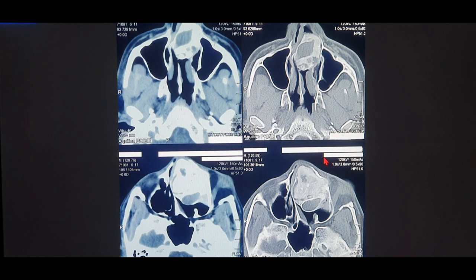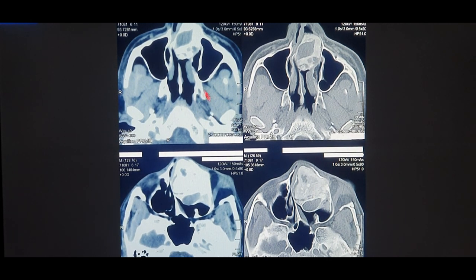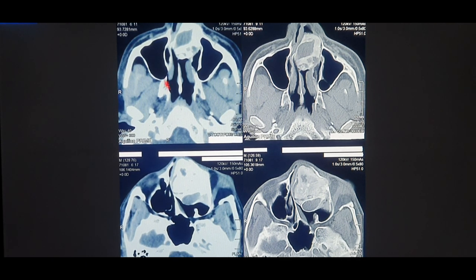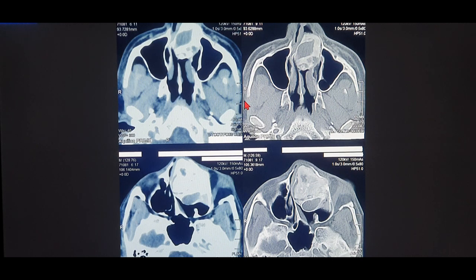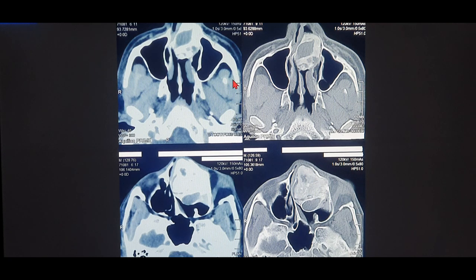After watching this video, you'll be able to easily identify a bone and a soft tissue window. As you can see on the screen right here, on the left side is a soft tissue window and on the right is a bony window. I'm giving you a sideways view so you can easily compare using three points.